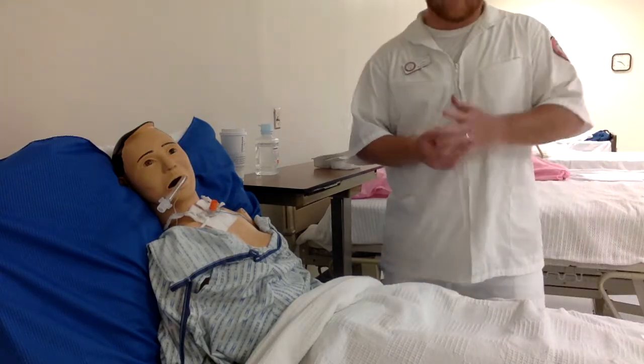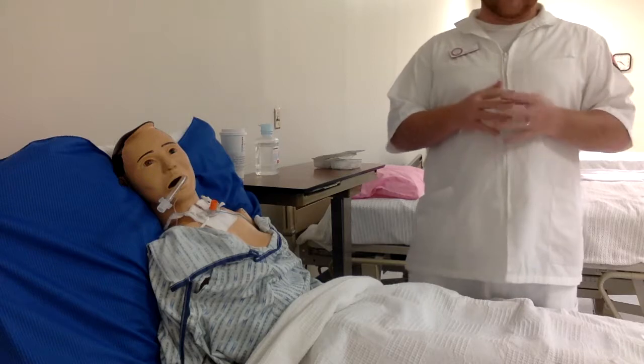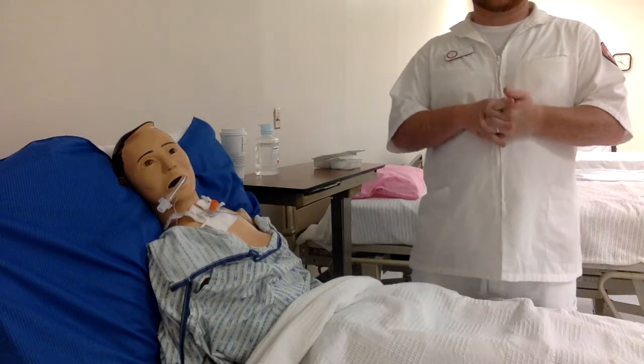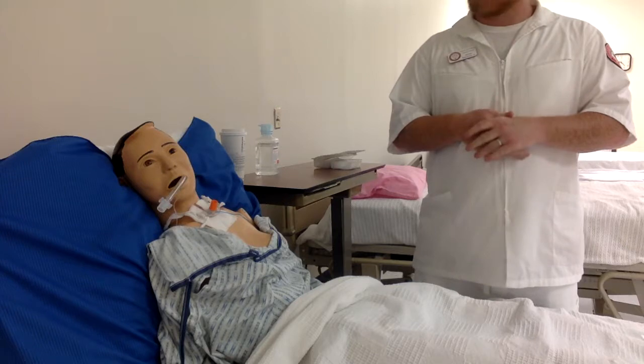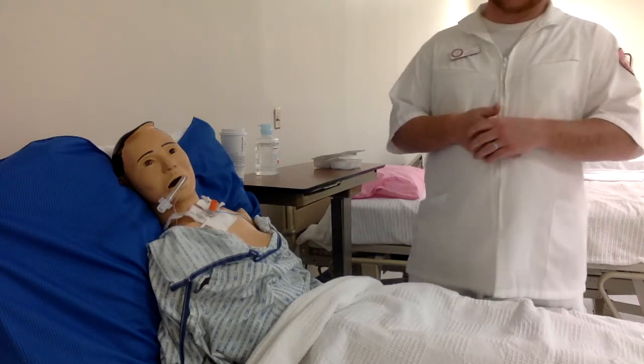Hello, my name is Altibioveno and today we're going to talk about tracheostomy suctioning. First off, you need to check your physician's orders compared to your procedure card. Make sure that the patient has a tracheostomy suctioning order.